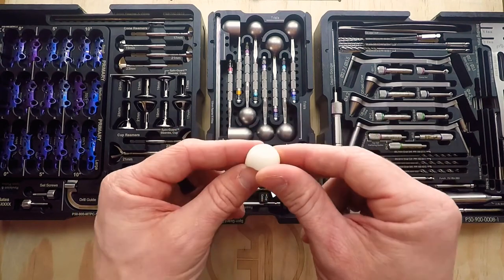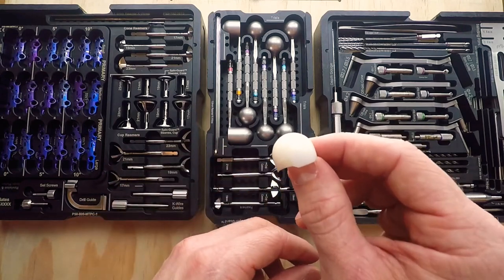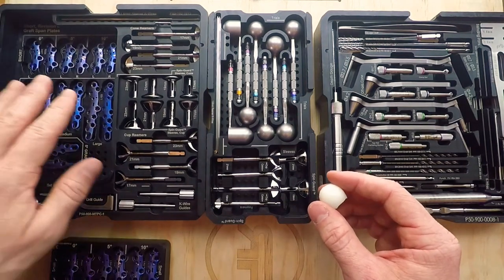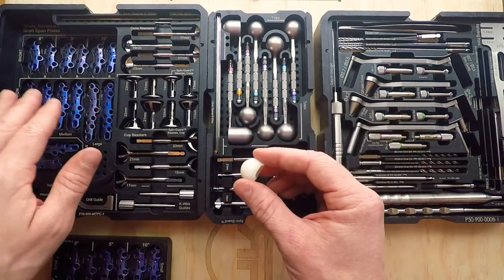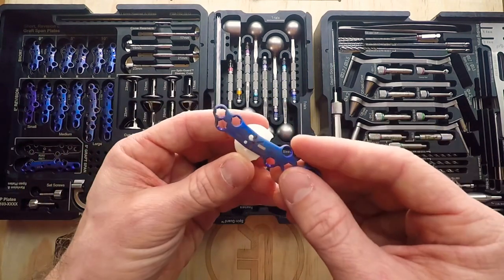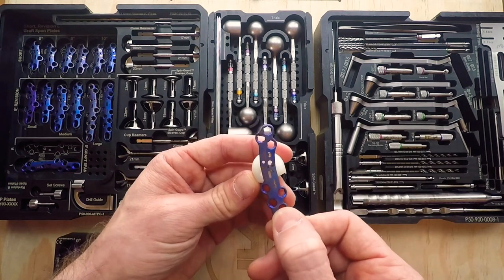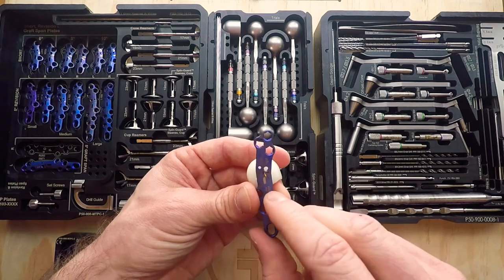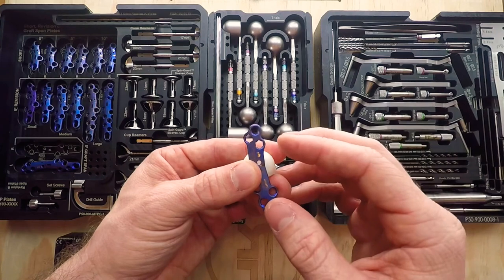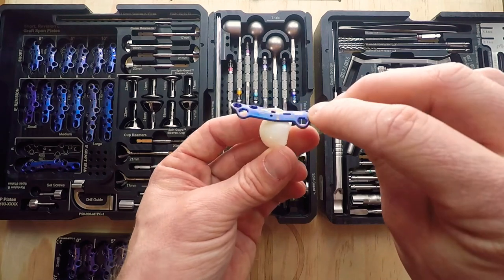We've seen that these grafts have a better union rate, and we have data to back that up in our technical monograph. These grafts work extremely well with these plates. Any of these revision plates — or really any plate that will span the graft — will work, though the revision plates are most commonly used. Occasionally, if we go with a longer graft, we can use the graft spanning plate to make sure we have enough length. You can see that the distal holes are missing the graft and the proximal holes are missing the graft. It's about 50-50 in my experience whether a crossing screw is used or not.